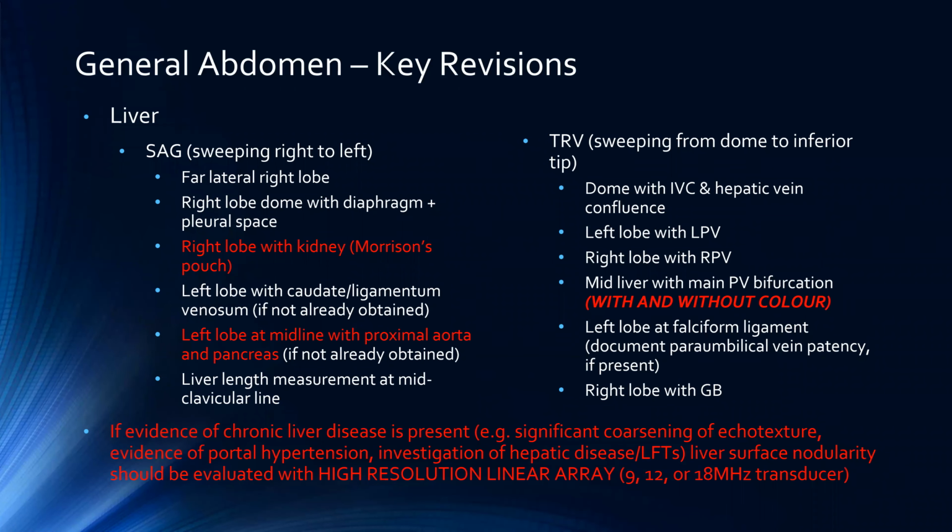In terms of liver imaging, it's a busy slide. I think, again, most of this is already in all of your routines. For the most part, we just need to be taking representative images in sag and transverse, sweeping from right to left and sweeping from dome to inferior tip of the liver.